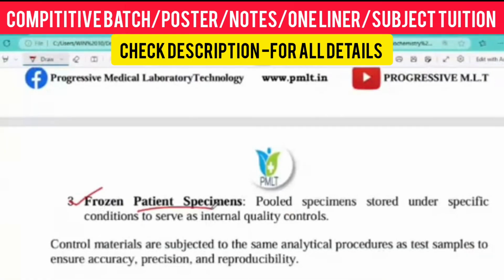Frozen patient specimen means a pooled specimen from some certain patients. We have to control it as well as preserve it for internal quality control purposes. Okay, so that we will understand what materials are required.